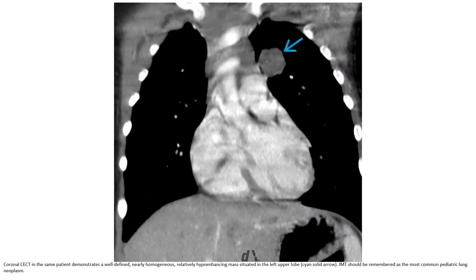Coronal and axial CT in the same patient demonstrates a very well-defined, nearly homogeneous, relatively hypo-enhancing mass situated in the left apex. IMT should be remembered as the most common pediatric primary lung myofibroblastic tumor.